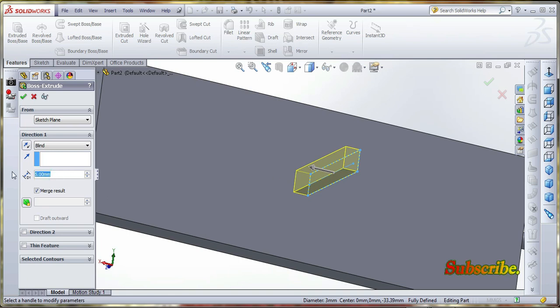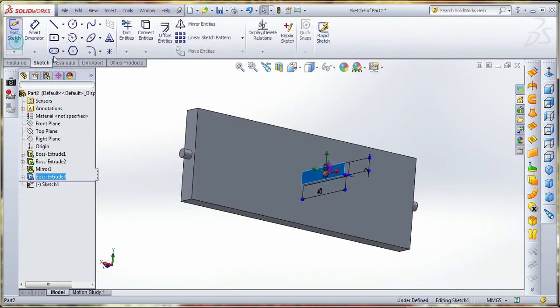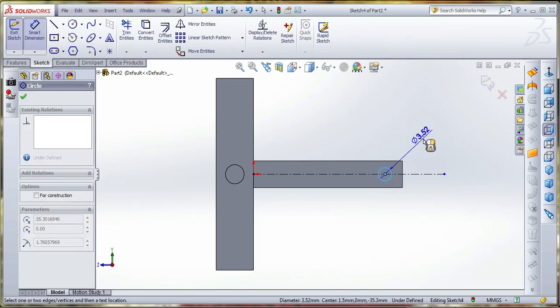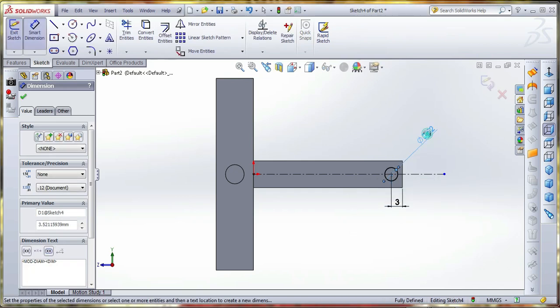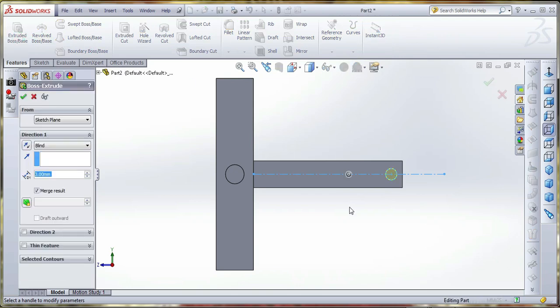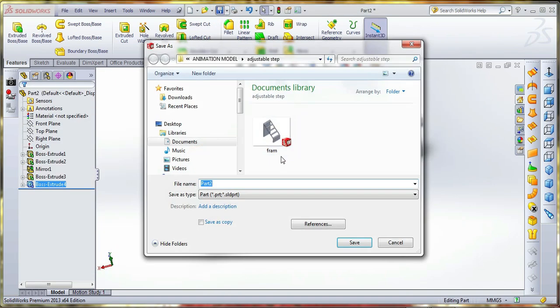Extrude mid plane 3 mm. Extrude mid plane, the last one, and choose the last one. Okay. Now going to draw the locating pin. The oscillating mechanism is locating on this particular pin. Extrude. This is 80. Okay. Going to save the step.